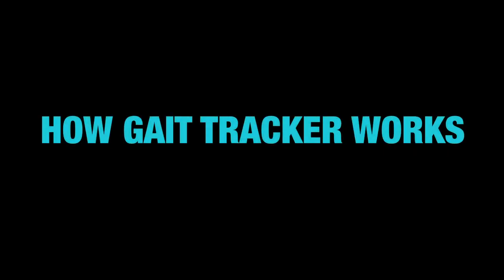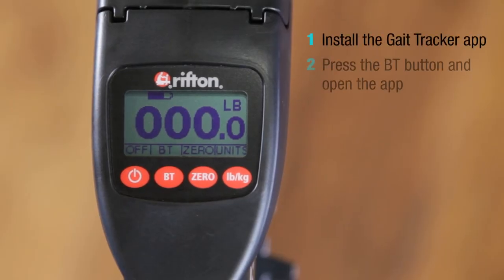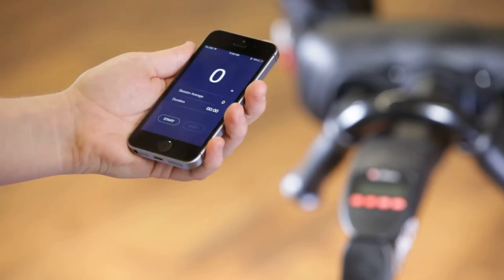With the Gate Tracker app installed on your device, activate Bluetooth on the scale by pressing the BT button. Your device will pair with the scale when you open the app.